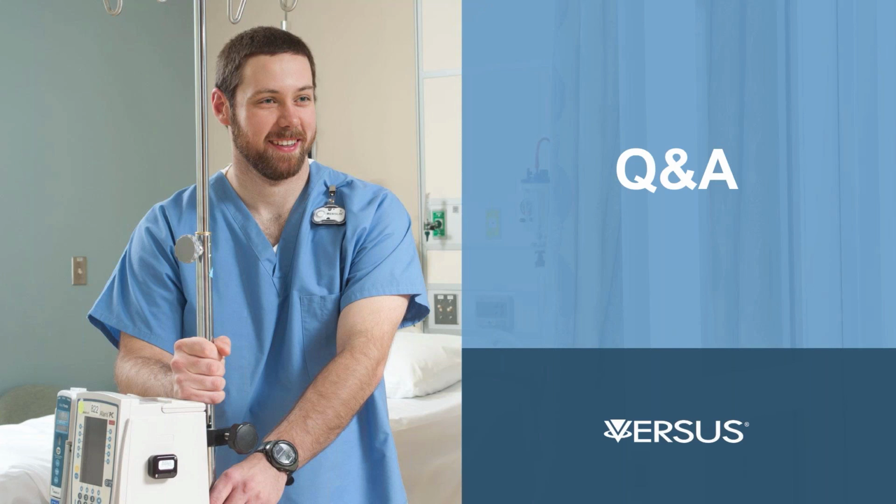Sometimes there's even an ability to do some sort of staff emergency or staff assist, whether a button on the badge or some other way to trigger it that provides them immediate assistance when needed, plus that passive functionality of presence, turning off a dome light or canceling a call. So it's about trying to tie everything back to patient care and what a system can do for nurses or doctors, who are even more of a challenge. What's that ROI for them? We had that OB situation I talked about, an L&D project, labor and delivery. The buy-in from our OB providers was great.